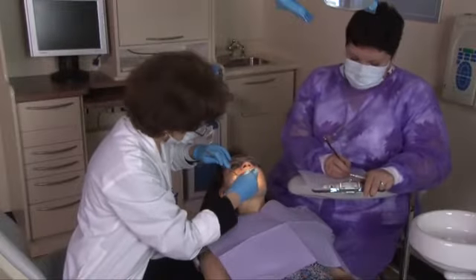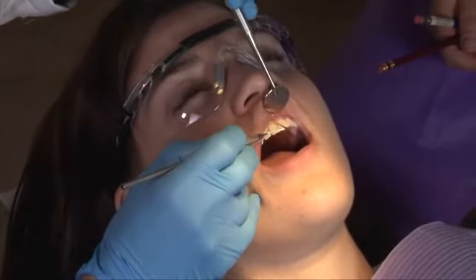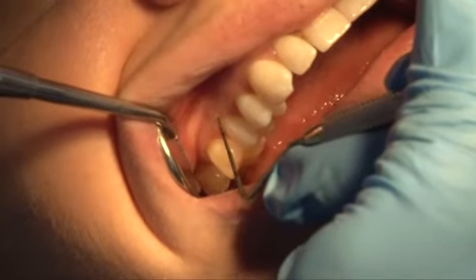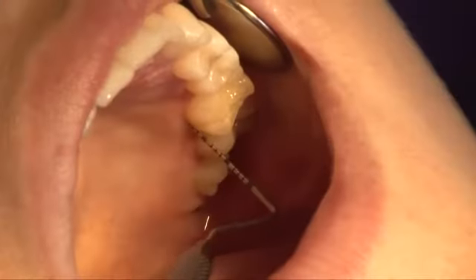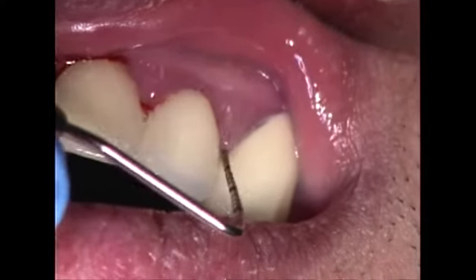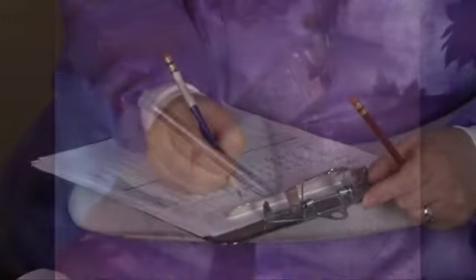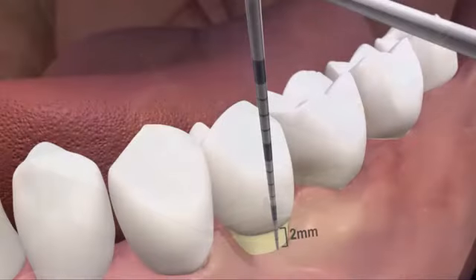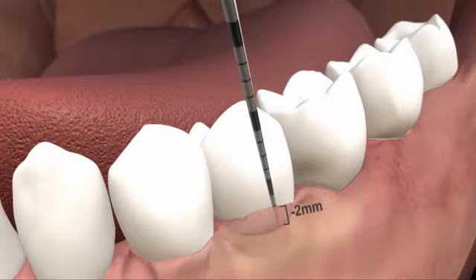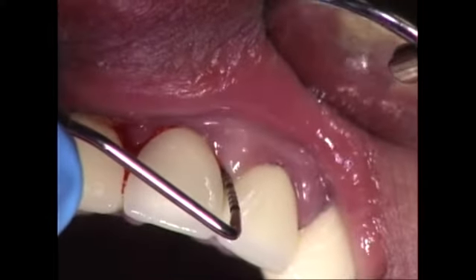Using a periodontal probe, the dentist will then determine if the patient has gingival pockets and/or recessions. Measurements are taken at 3 sites on the facial aspect of each tooth and 3 sites on the lingual aspect. The probe is inserted into the pocket gently but firmly until it meets with resistance. It is walked around each tooth, and the deepest pocket measurements are recorded. The recession measurements are recorded as positive numbers or as negative numbers when the gingiva is extending above the junction between the root and the crown of the tooth. Sites where the gums bleed during probing are also recorded.